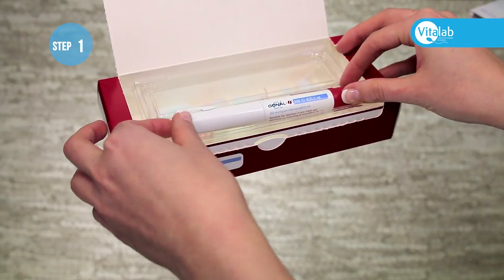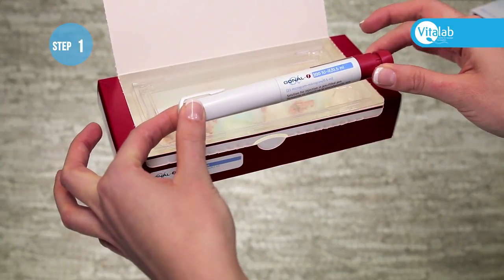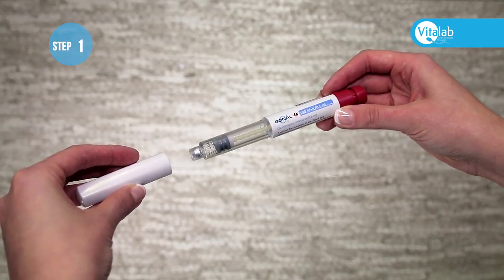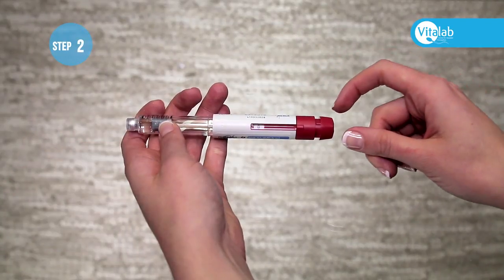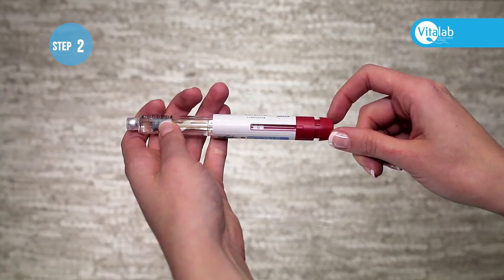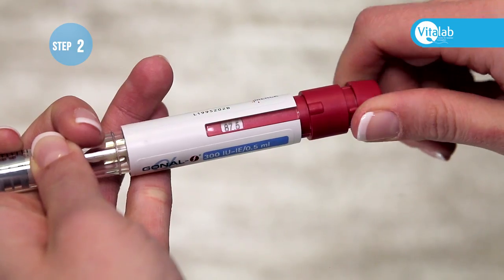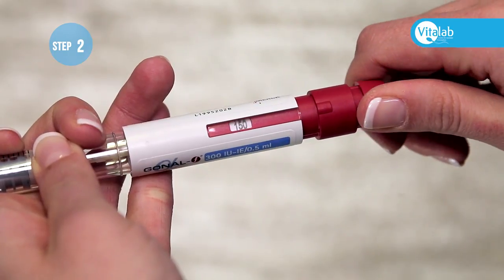First, open the box and remove the pen. Pull the cap off the pen. Next, dial in the dose by turning the red part at the end of the pen until your prescribed dose is visible in the window on the side of the pen.